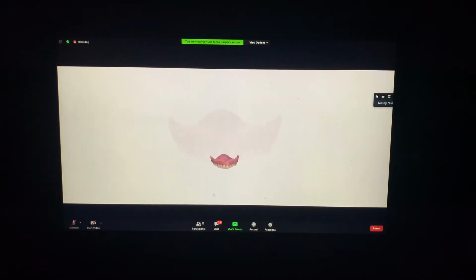And with it, now I can also have a facial scan.